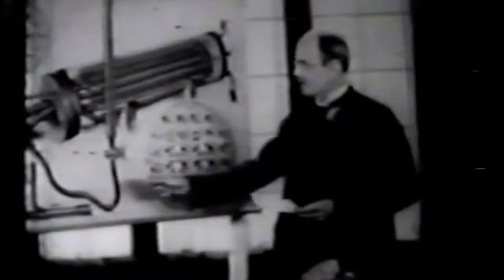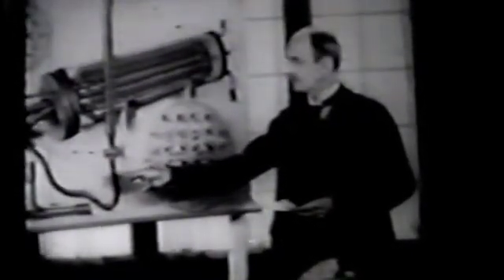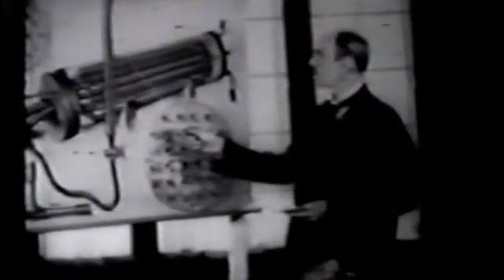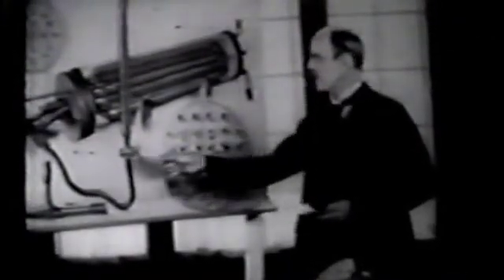The substance that is mixed with the blood is allowed to enter the apparatus at this point. From this tube, this substance in solution meets the blood as it enters the apparatus and prevents it from coagulating. It is a substance obtained from the upper part of the digestive tract of leeches.